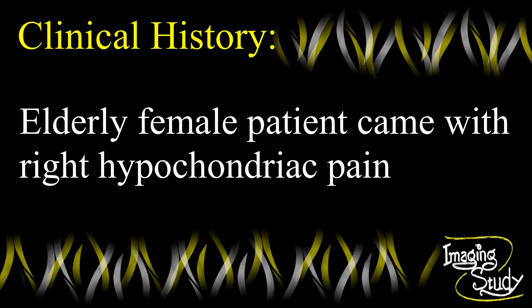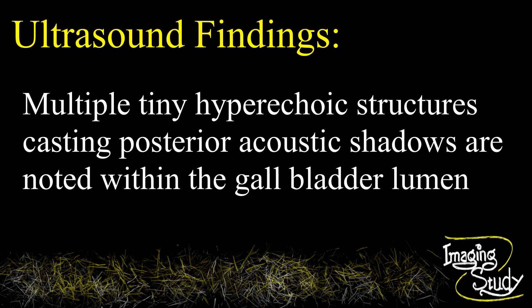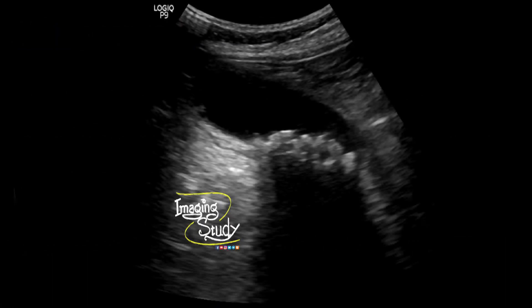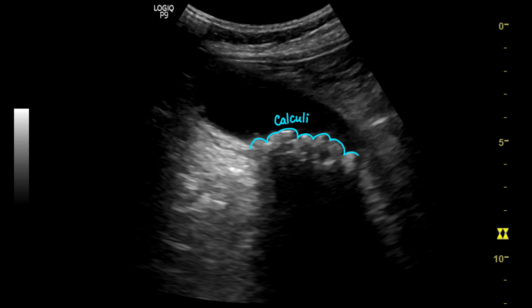An elderly female patient came with right upper abdominal pain. On ultrasound, multiple tiny echogenic structures casting strong posterior acoustic shadows are noted at the gallbladder lumen. Here you can see the tiny hyperechogenic structures at the gallbladder lumen at the region of the neck, casting posterior acoustic shadows.